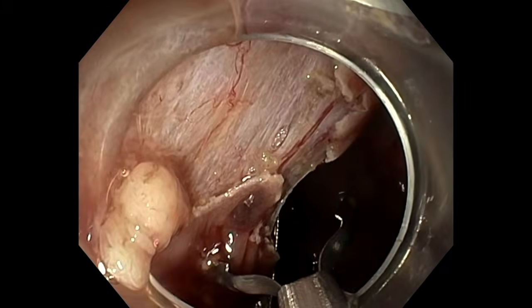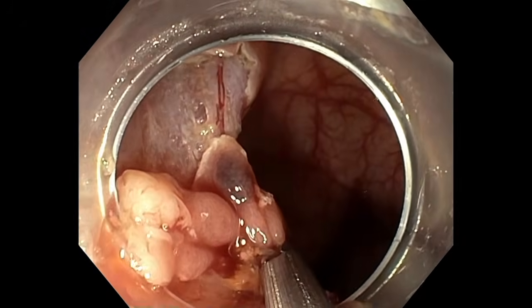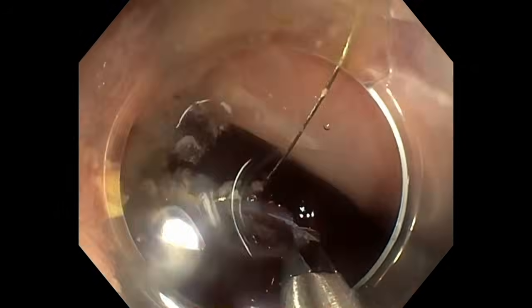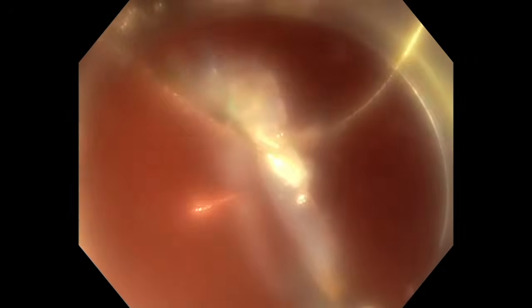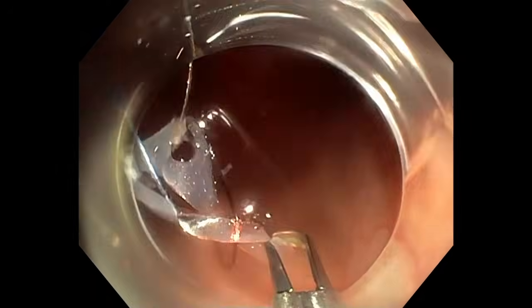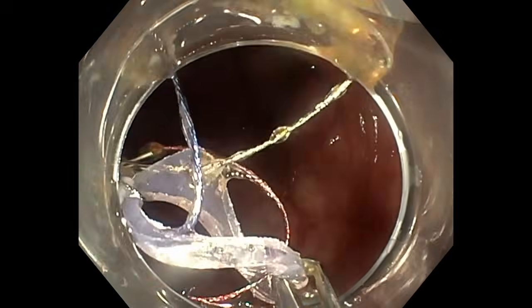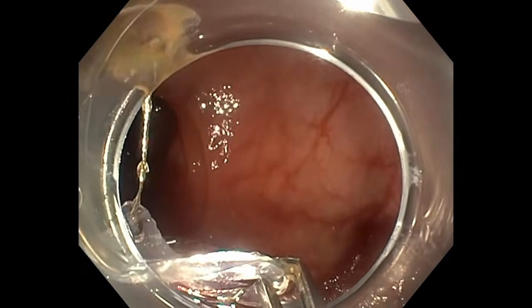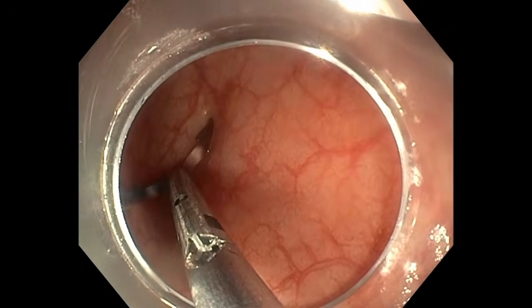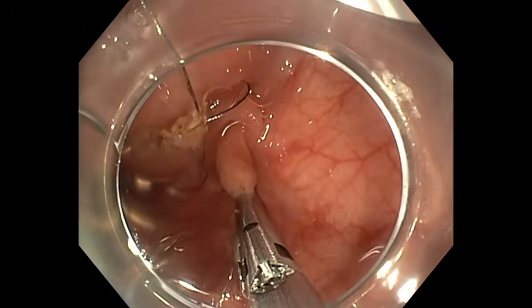Here is the moment where I put my lateral traction on the edge of the lesion. Once again, my goal is to have only the muscle retracting sign at the end of the resection. So I use the rubber band to track the lesion to the opposite side. It will track the muscle, it's true, but on the opposite, it will help me to find the blue layer and to go faster also, because by condensating the fibers, I will cut more fibers during each spike of the knife. So it is the strategy with multipolar traction.